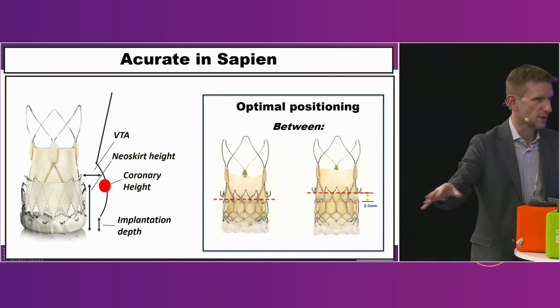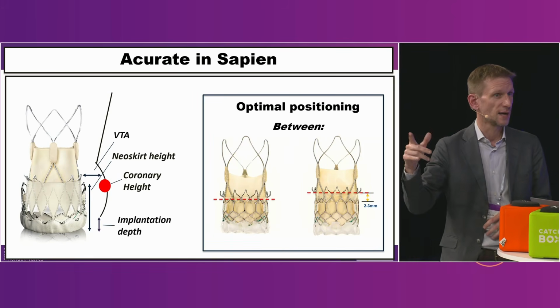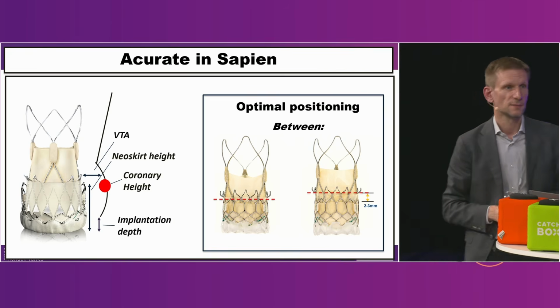No, I would think, one has most experience with putting ACURATE in a SAPIEN, or in a surgical valve for sure. I would think the risk if you put it too low, then the upper crown is sitting into the SAPIEN stent frame, you will have bad hemodynamics for sure. And I would even be scared placing it at 3 millimeters above the SAPIEN. I think you can get away with it, but if it goes higher, you may have a real risk of pop-up. But it's not just a pop-up. It's also because you need to grab completely the leaflets of the SAPIEN. Yes, because otherwise you just pinch the tip of the leaflets, like the mitral clip, which is not the way to go. Yeah. No, perfect. Great.